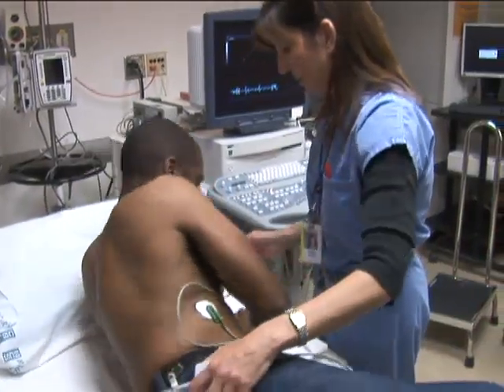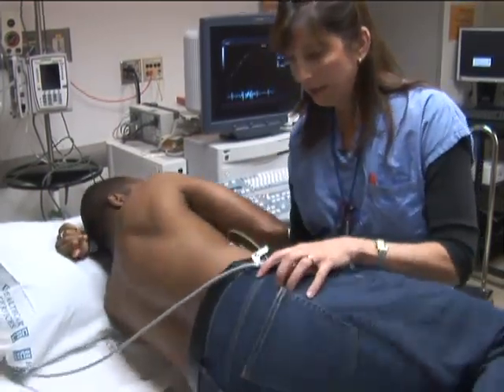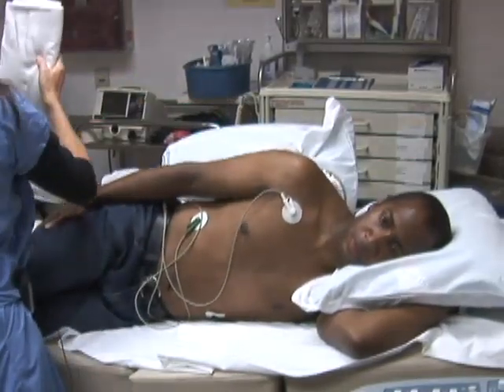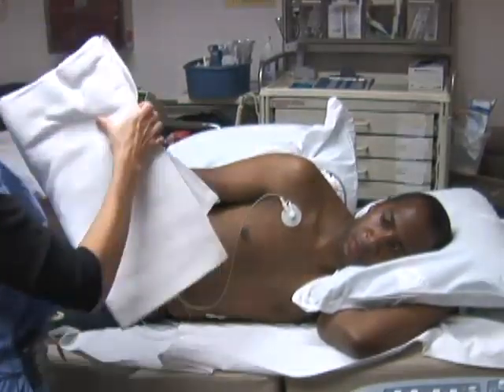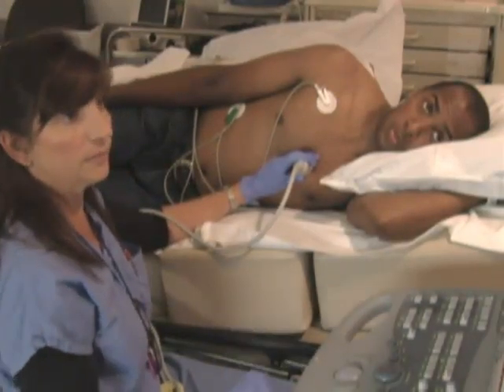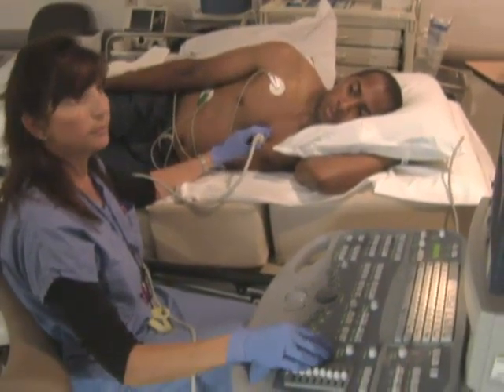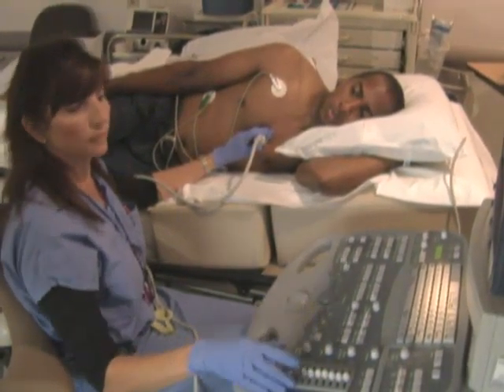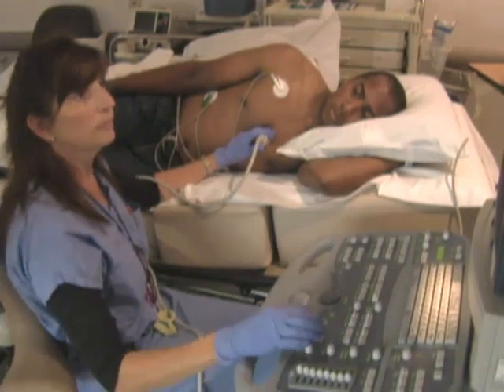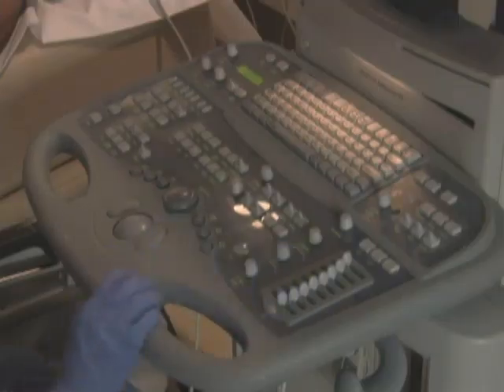The patient is asked to turn into a left lateral position with the approximate location of the cardiac apex over the cutout on the stretcher, and the patient's head comfortably supported with a pillow. The sonographer sits at patient's left side on a wheeled stool with the height and positioning adjusted to allow access to the instrument panel with the right hand, while holding the transducer on the patient's chest in the left hand.